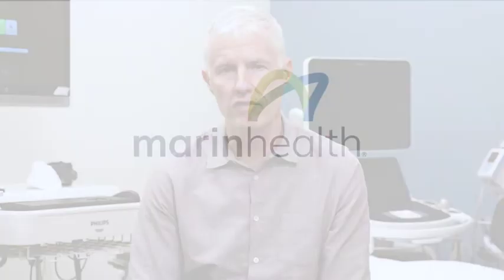Or we might just find that everything looks okay and the person just needs to change how they're training or exercising in order to improve how they're feeling. So most commonly we would use this test to evaluate someone who's feeling short of breath for any reason in the patient population. But for an athlete, we may use the same test to say, how do I run faster? How do I bike longer? And really we take the same information gathered from this metabolic cart, and we can use it to help patients or athletes in different ways.